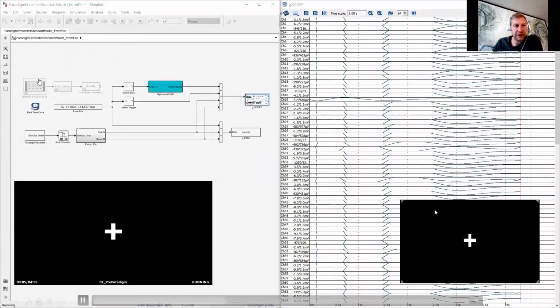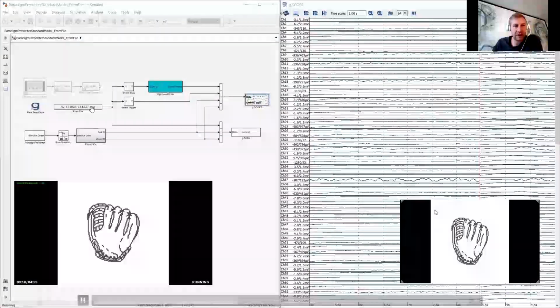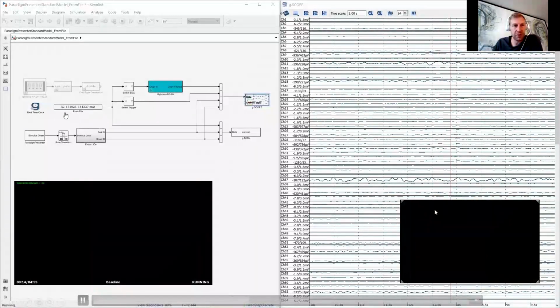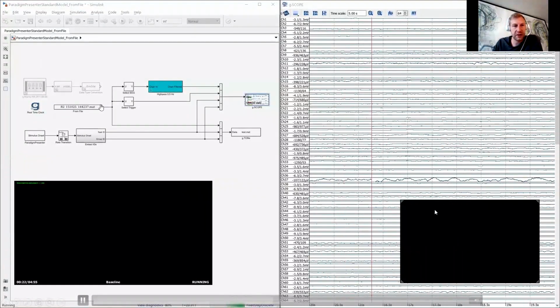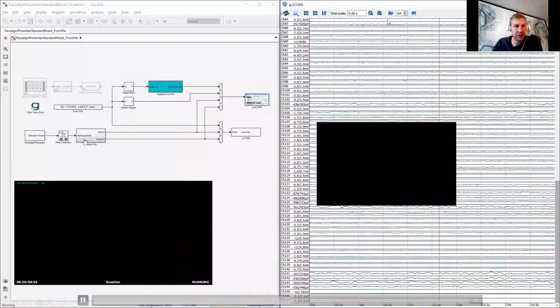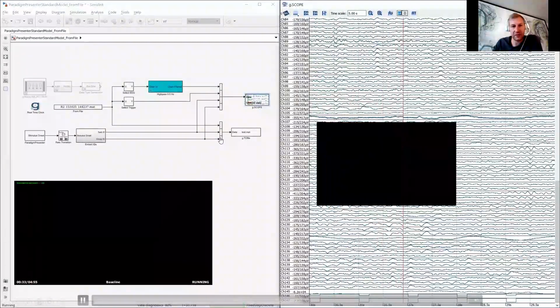So here you can see this is the amplifier block for an actual online experiment. And here this is a file replay block when we want to replay previous sessions and analyze them retrospectively. So this is also very nice to simulate real-time experiments so that we can first test and be sure that everything is correct. Here's the presenter block, and we get the task ID and the group ID as channels. So this is the trigger information.